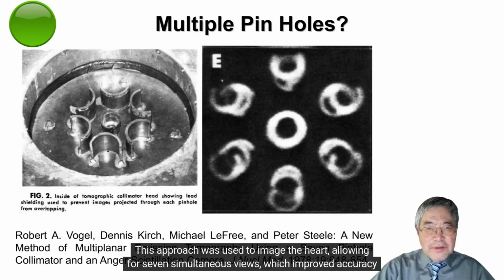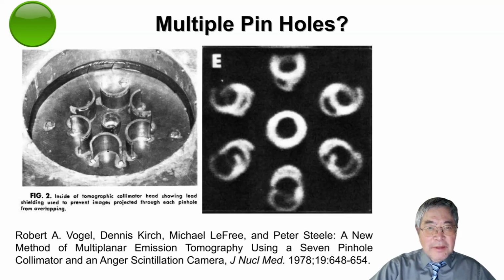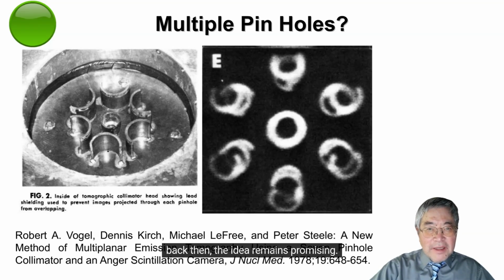This approach was used to image the heart, allowing for 7 simultaneous views, which improved accuracy by acquiring several perspectives at a single time point. Although the reconstructions from those 7 views weren't fully impressive with the technology available back then, the idea remains promising.